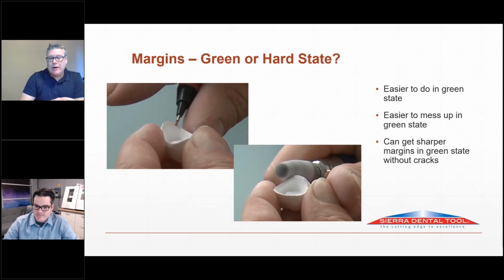But you're not contouring the crown here. You're just cleaning up where you put the two connectors on the lingual. You're cleaning up any other area. Maybe you're redefining the anatomy a little bit, because using that 3.3 millimeter tool that we discussed earlier takes 3 minutes to do, but you can do it in 10 seconds because you're just working on the area that you want to elaborate on. Let's move on to the next slide, Greg.